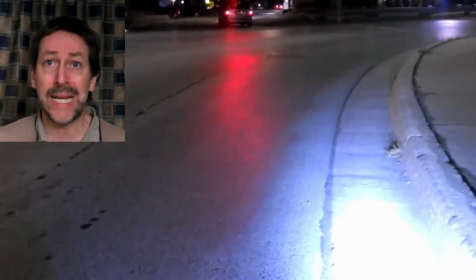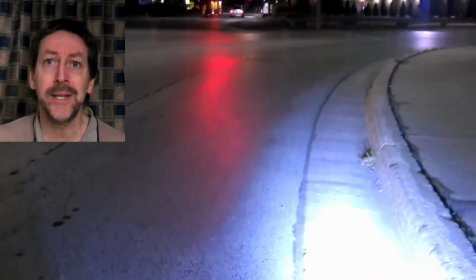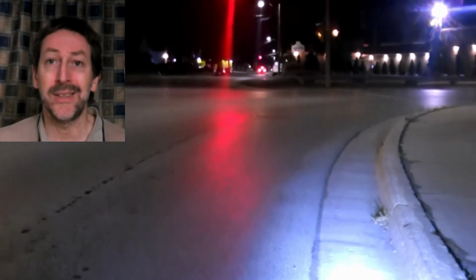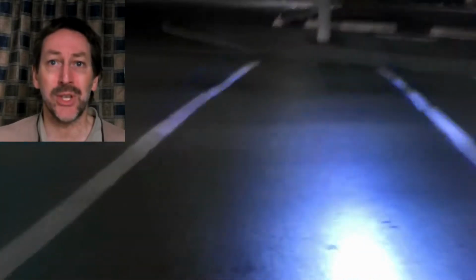Clearly, adding the white LED light is helpful. I would encourage you to do it. You may not have the skills and the knowledge that I do. Your point of contact would be an industrial electrician, or you could consider using some LED flashlights with rechargeable batteries. You would get the same result. It's a pain having to recharge the batteries continually. But if you're not out at night all the time like I am, it is a practical answer.